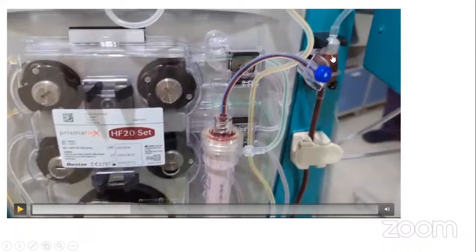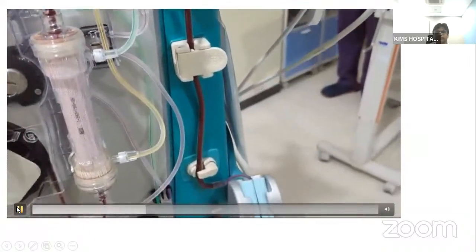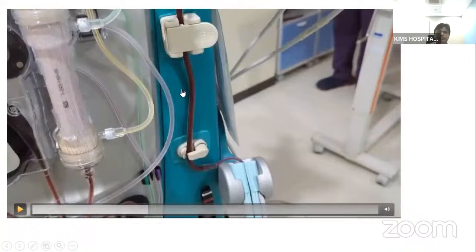If there is any direct contact, the risk of clots will be very high. So most of the time the contact is between blood and replacement fluid, followed by air. After the replacement fluid gets added, the blood goes through this bubble detector. Any air bubbles get detected here, and from there the blood goes into this clamp. If the bubble detector detects any air bubbles, this clamp will automatically fall, and this prevents the bubble from entering the patient.